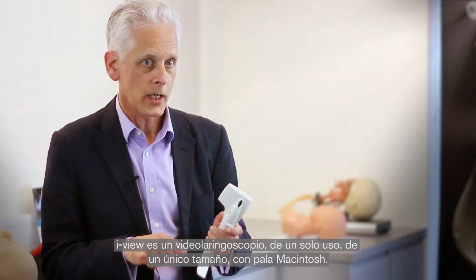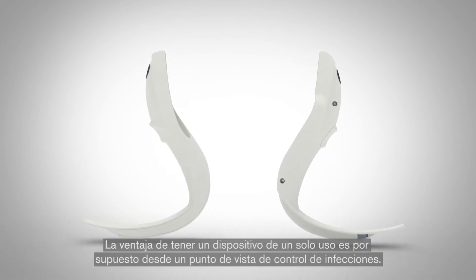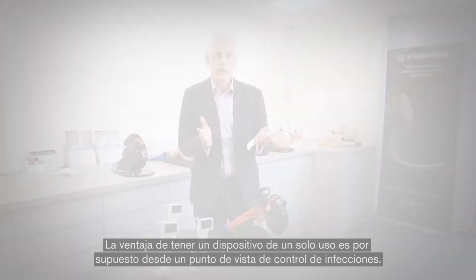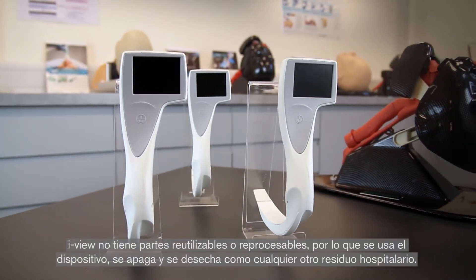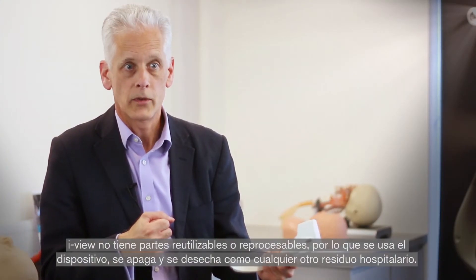iView is a one adult size, single-use video laryngoscope with a Macintosh blade. The advantage of having a single-use device is of course from an infection control perspective. There are no reusable or reprocessable components on iView, so as a result, you use the device, turn it off, and then it should be put into clinical waste for disposal.